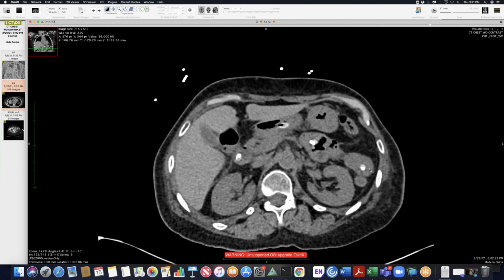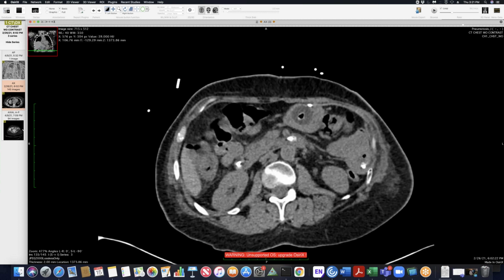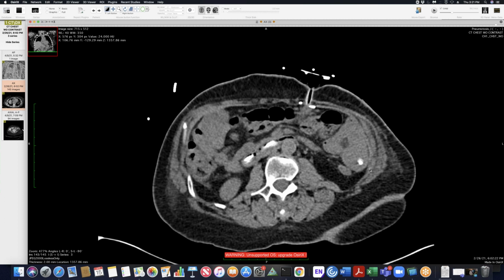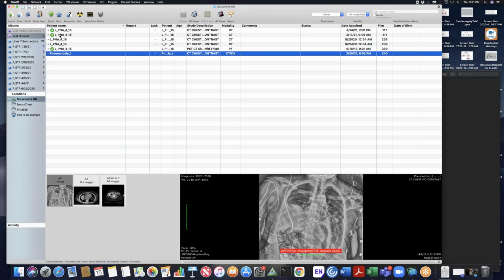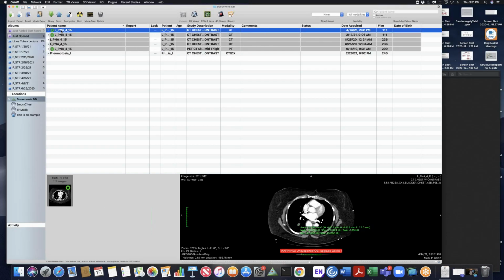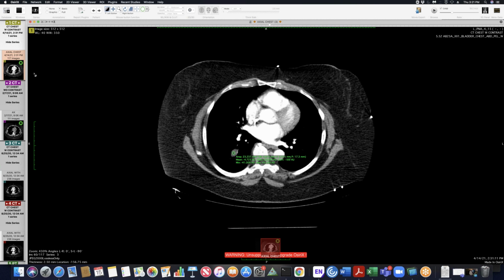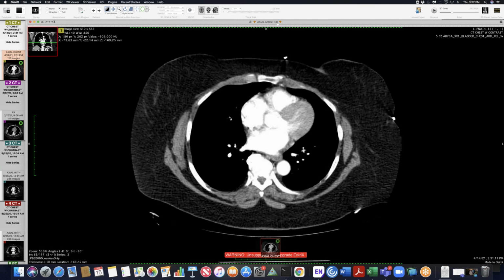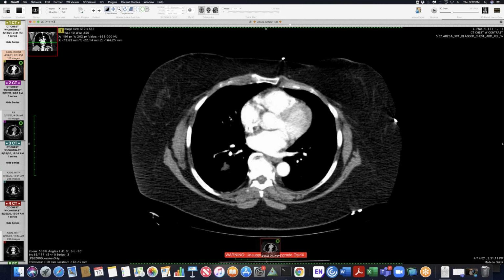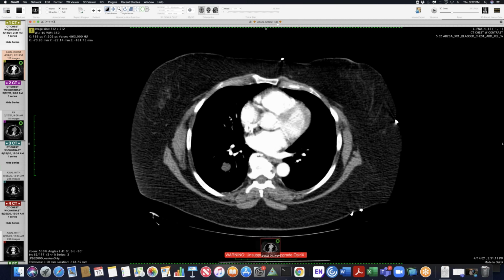Yeah, I saw one the other day on a follow-up radiograph that has persisted now for a few months, I think. This is pretty much the same. You can see it probably started off slowly and then gradually got a lot more impressive. But I guess the only thing they did is stop the CellCept. There's no surgical intervention other than just going in and checking.